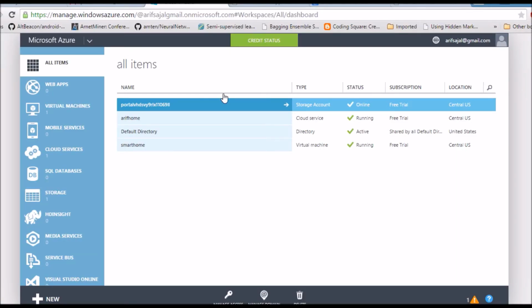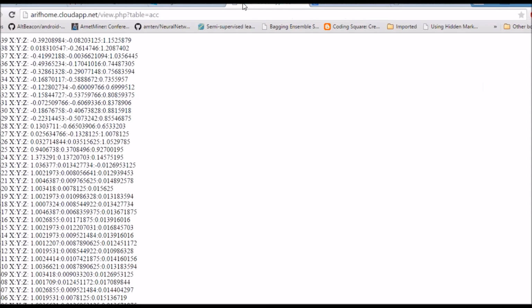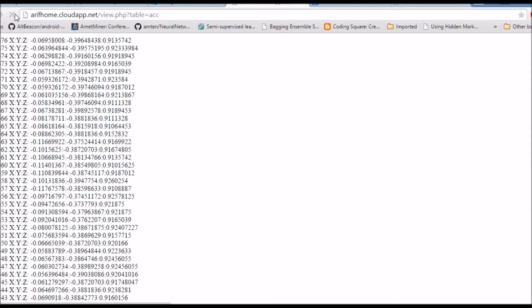This is the Windows Azure server page where we can see that we have created one virtual machine, one cloud service, one storage, etc. And here we can see our web page that we created to display the accelerometer data. The accelerometer data is saved like this, with XYZ axis values colon separated, which was extracted on the WPF app side. Here it is real time and you can see it is updating every second as our Android app is getting the accelerometer data from the Microsoft Band and sending it over the web service, and it's saved in the cloud server's MySQL database.